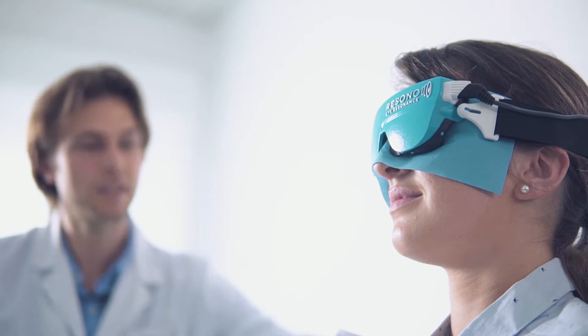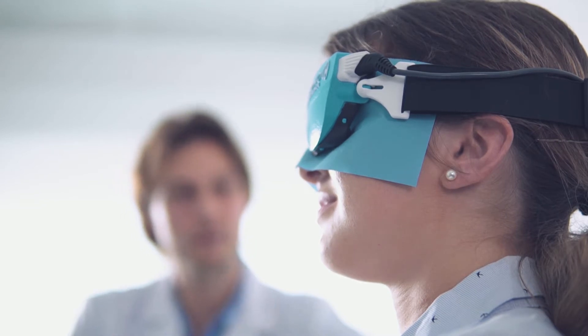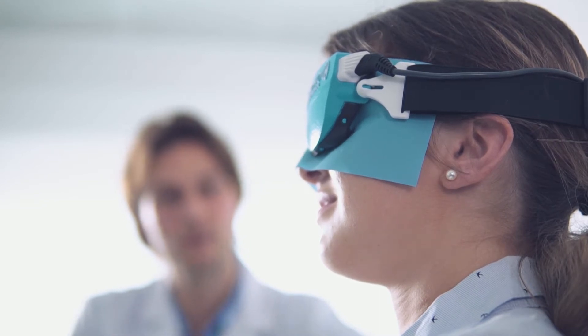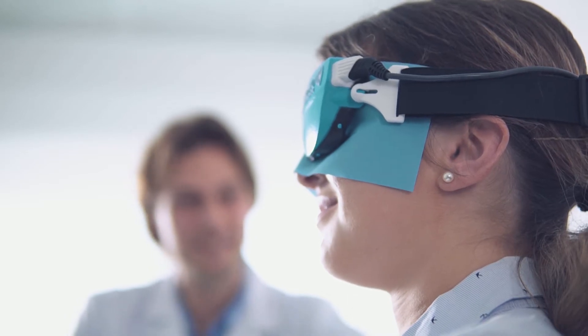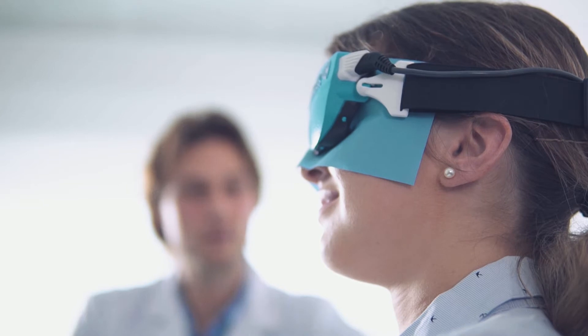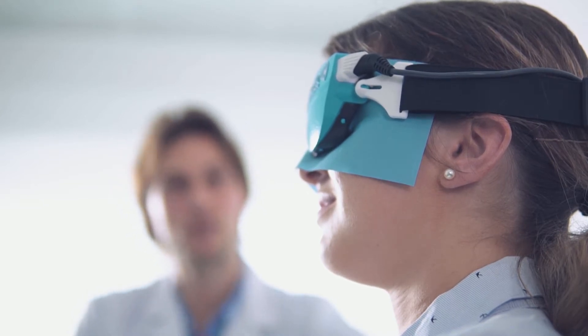The treatment lasts 20 minutes and is delivered to one eye at a time. After one or two minutes, you will feel a slight and pleasant warming sensation. Now, sit back and relax. You can even fall asleep. Just let me know if you feel more heat on one eye, and I will slightly adjust the position of the mask.